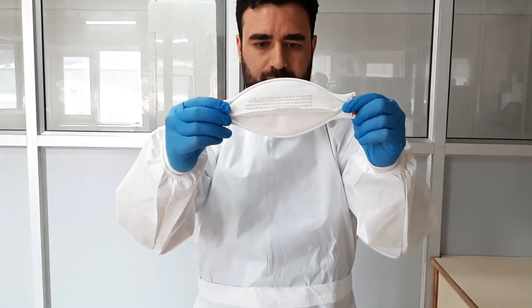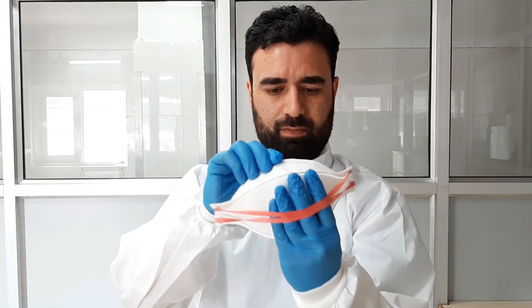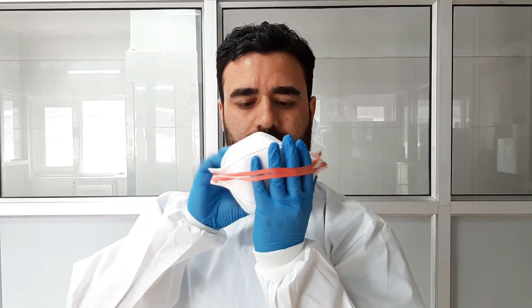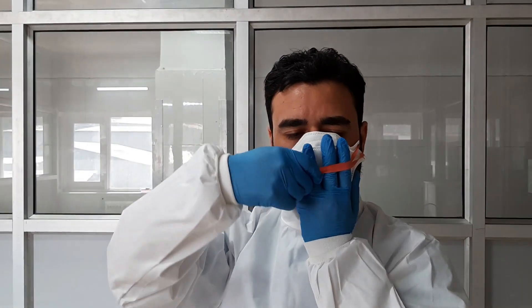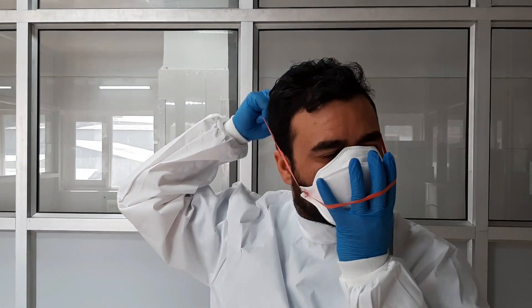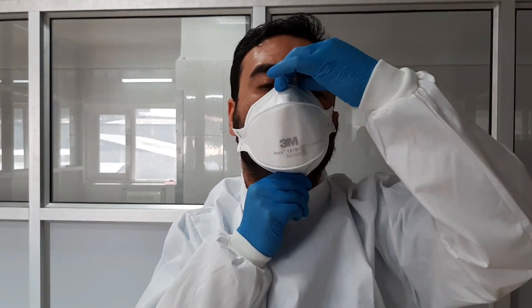Wear your N95 mask properly by placing it on your nose, adjusting the bands, and fit-test it. Presence of facial hair may interfere with the sealing of the respirator. Such individuals may tuck their beard into the mask.